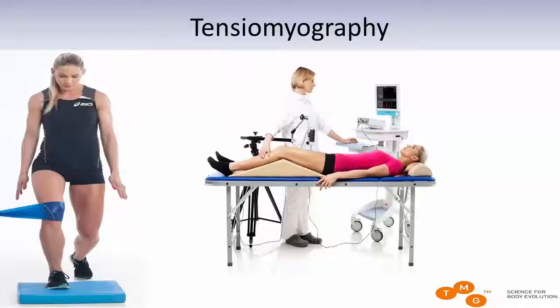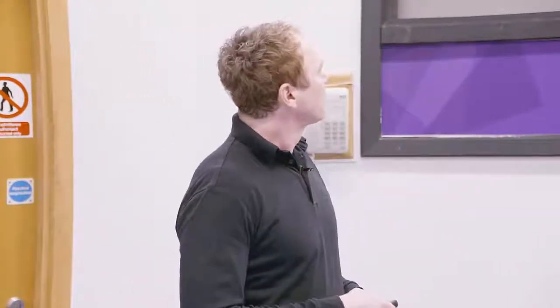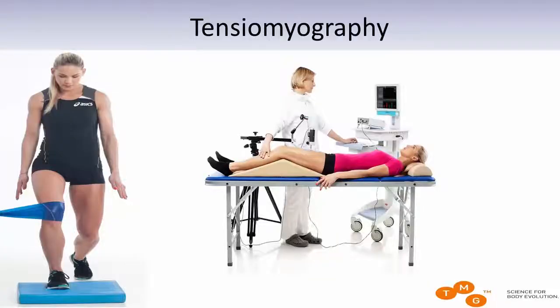Of course, we need some accessories to make the measurements easier and, let's say, more objective. This is the whole setup. You can see it also here. So, as I said, the subject has to be relaxed in either supine or prone position when you're measuring legs. If you're measuring upper body muscles, in some cases it has to be in upright position, but let's focus on this. So we have a massage bed here.